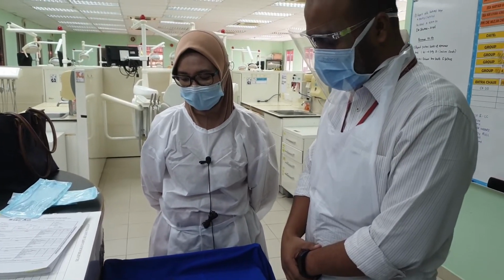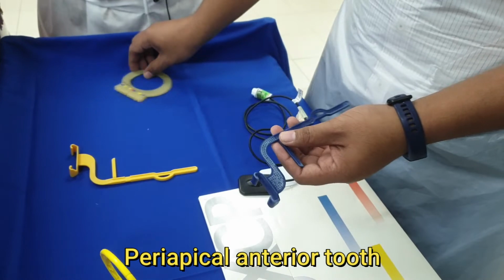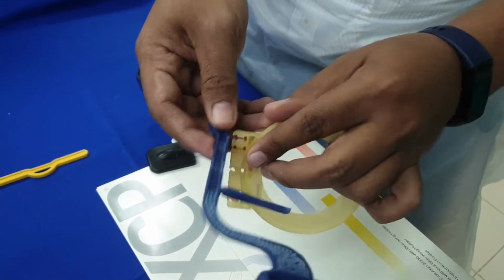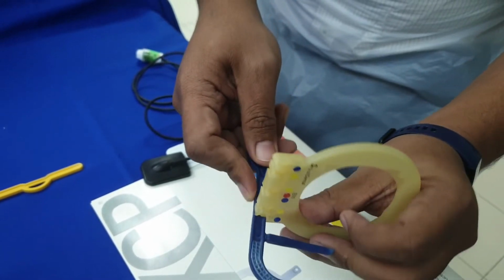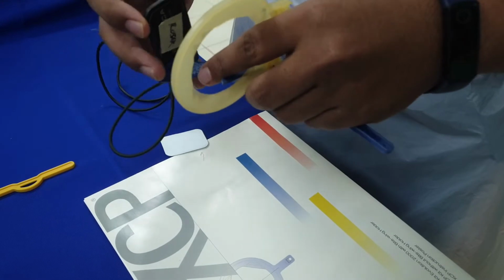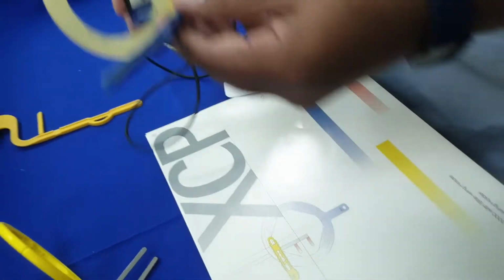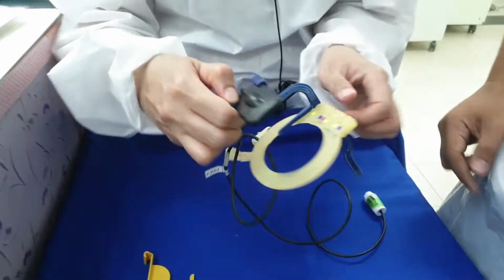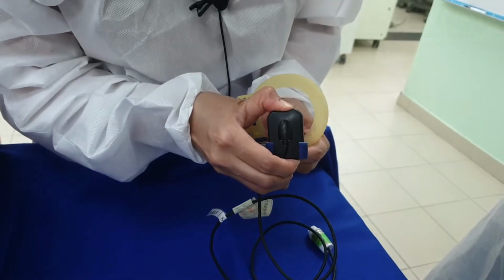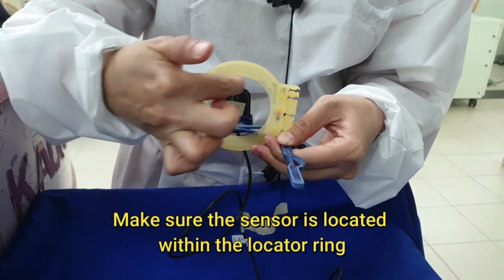We'll show you how to take digital X-ray for anterior teeth. Get the holder. The locator ring, again, observe the color for periapical. Digital sensor. When you want to take periapical, please note where the digital sensor is placed. Look, it is not centrally located. Rather, it is placed a little bit higher, like that. This is to ensure that the image falls again within this diameter.